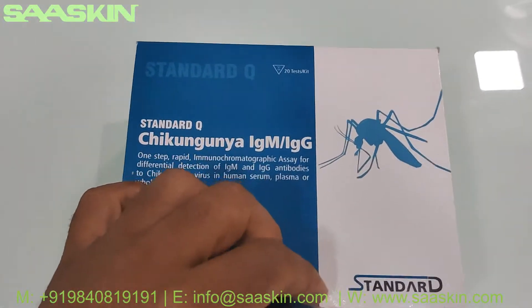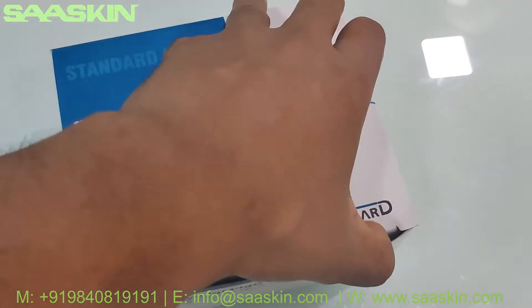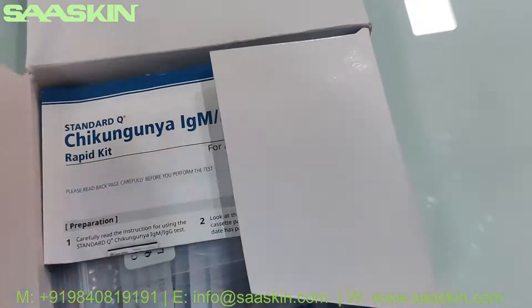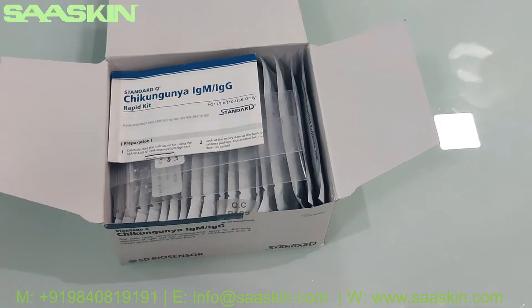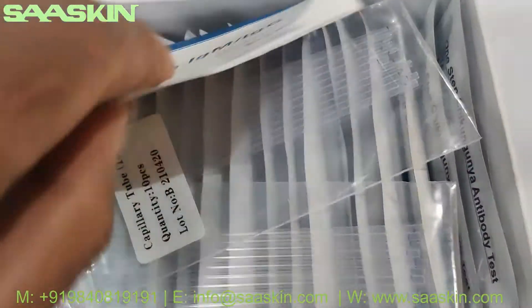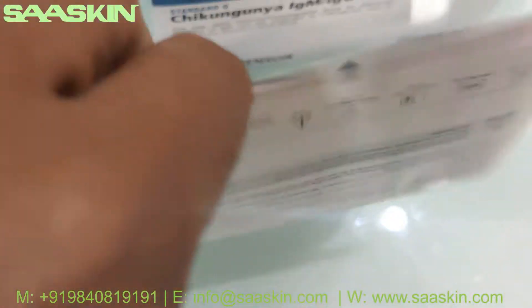This is how the box looks like — let me unbox this for you. This is how the inside of the box looks like; you've got an instruction manual inside.